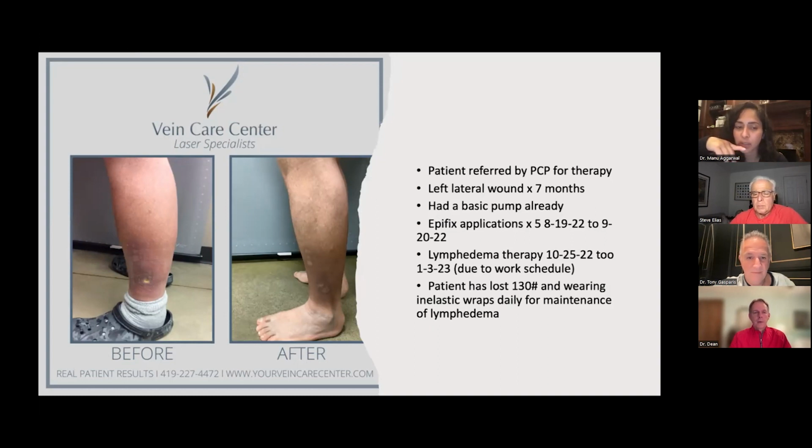Yeah, it's a great point, because we talked about this AVLS or UIP, and some of these patients are so edematous it's difficult to really assess their venous function, but you really want to make sure you're not missing a DVT. Some of these patients have had a DVT in the past, even superficial venous thrombophlebitis, and they didn't know because it just felt like a pulled muscle. You've seen some scarring of the vessels and things like that. So you make a good point to make sure you are evaluating these patients first from a venous standpoint, and also continuing them with their therapies.